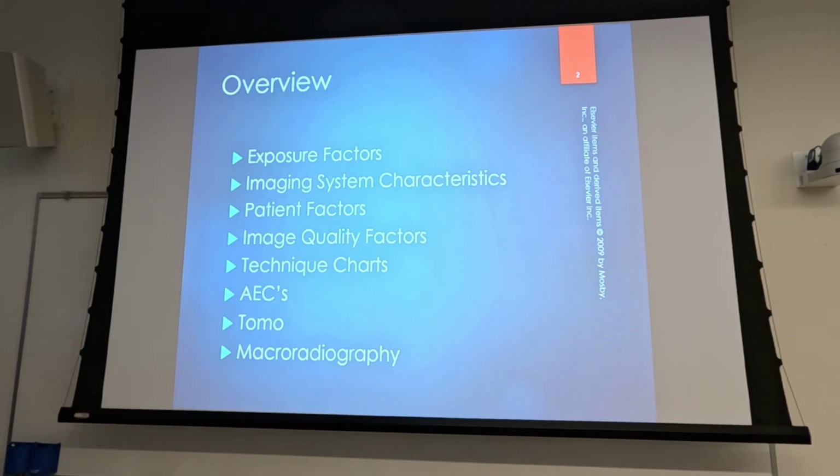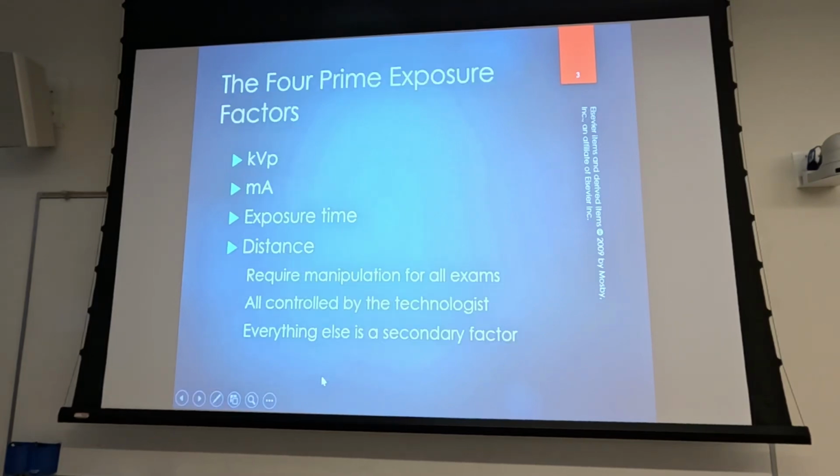The T in CT means tomography, and tomography is just using motion to try to get rid of some sort of artifact. And we're going to talk a little bit about macro radiography as well. And what macro radiography is, is intentional magnification radiography.